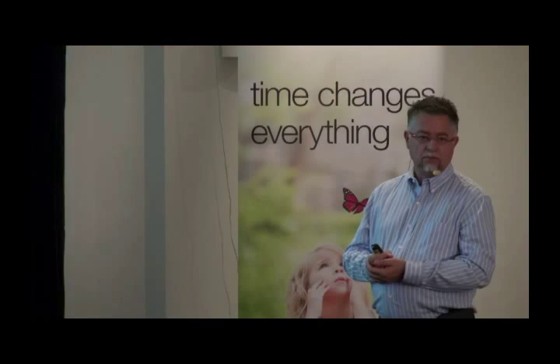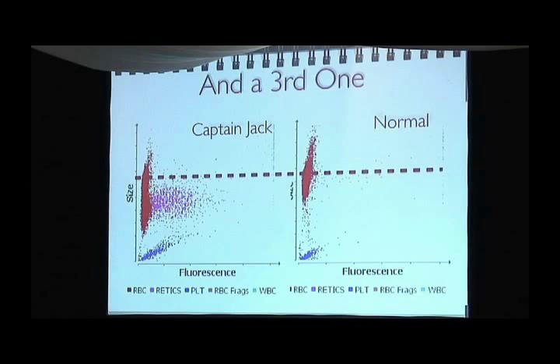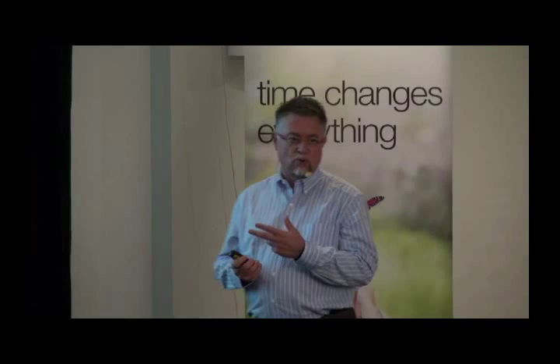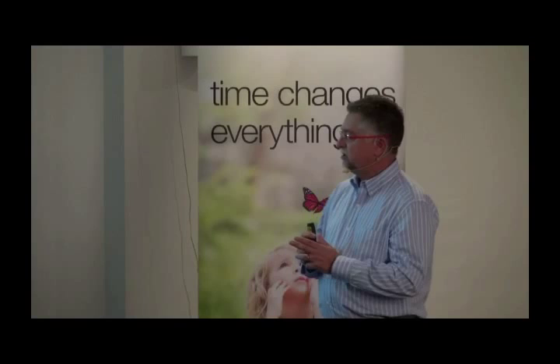Don't be shy now. Smaller, right? You see how they all live in the, you know, underground or in the basement? You also see a lot of reticulocytes, and this is a greyhound, so you see too many platelets, all right? So he has microcytic anemia with reticulocytes and thrombocytosis. He has iron deficiency anemia, all right? So this guy has hookworms that have first name, last name, and social security number, all right? So he's loaded with hookworms, and we treated him, and I have beautiful sequential dot plots after we treated the hookworm.